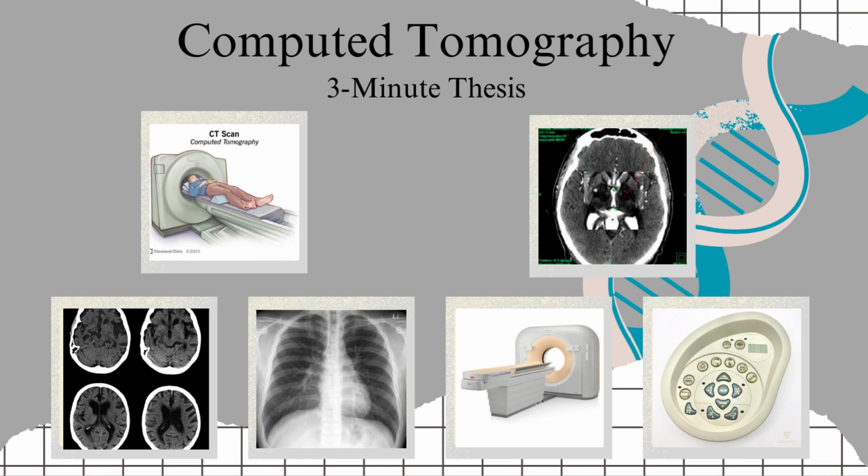In summary, computed tomography, which utilizes X-rays and computer processing to produce accurate cross-sectional images of the body, is an essential medical imaging technology. With continual developments aimed at improving its safety and capabilities, it plays a critical role in diagnosing and monitoring a variety of medical disorders, ultimately helping patients feel better overall and diagnosing the proper conditions necessary.